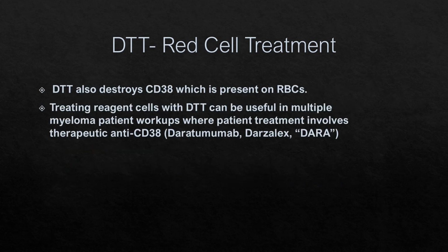DTT-treated cells are also used when we're working on a DARA workup. DARA is an anti-CD38 monoclonal antibody drug. DTT also destroys CD38 off of the RBC cells, so this is a very helpful method for dealing with this drug interaction.